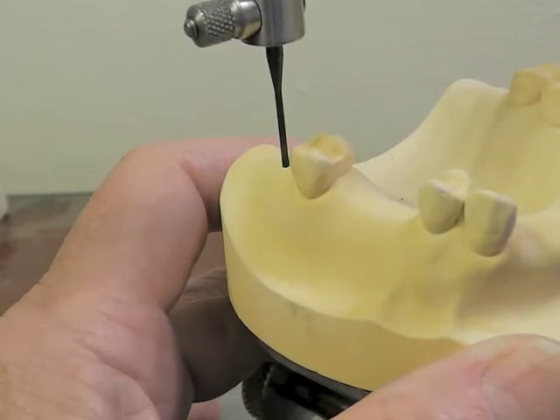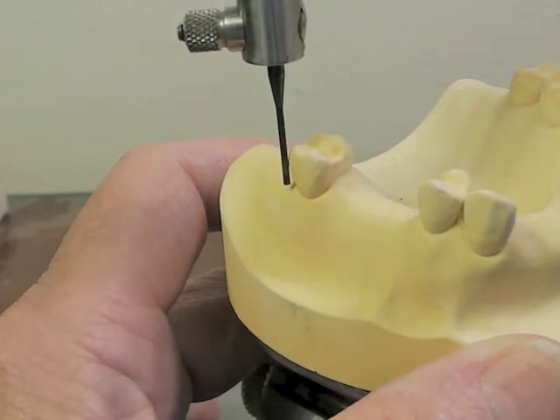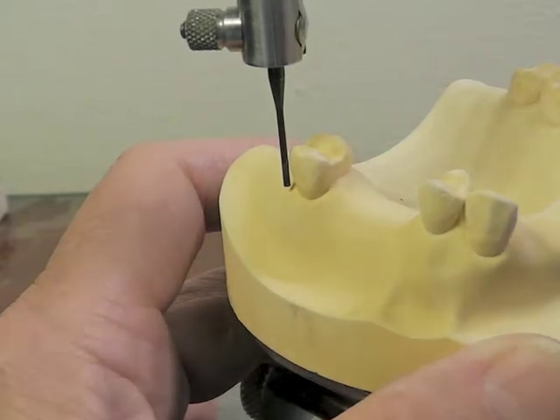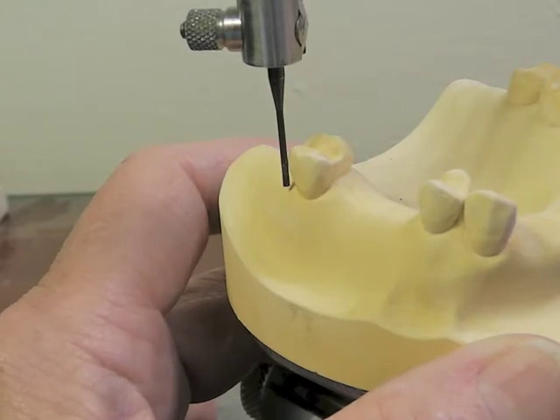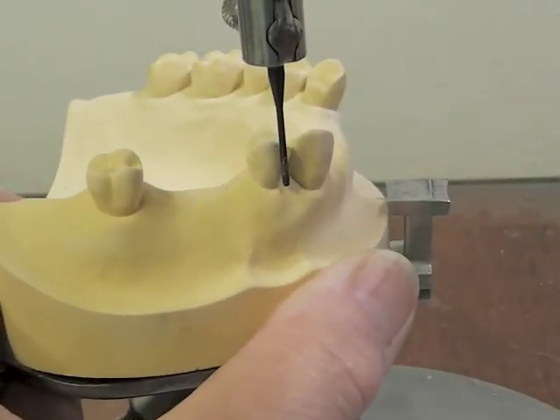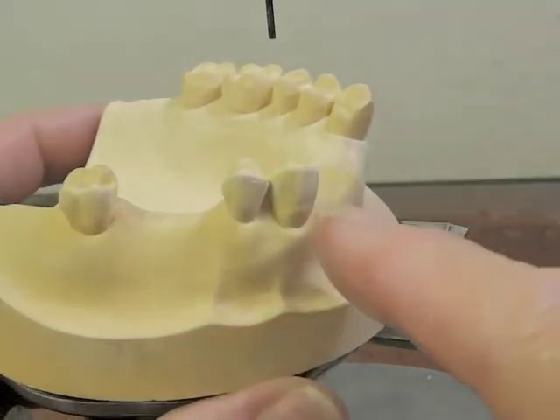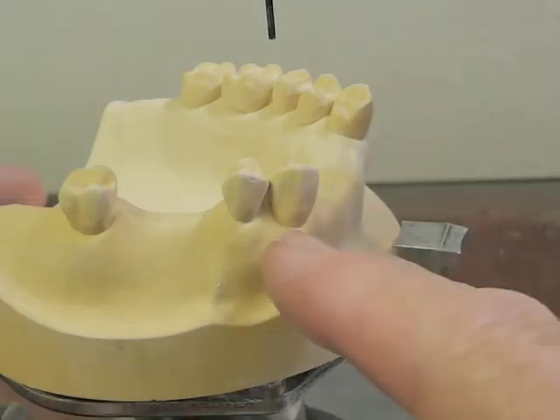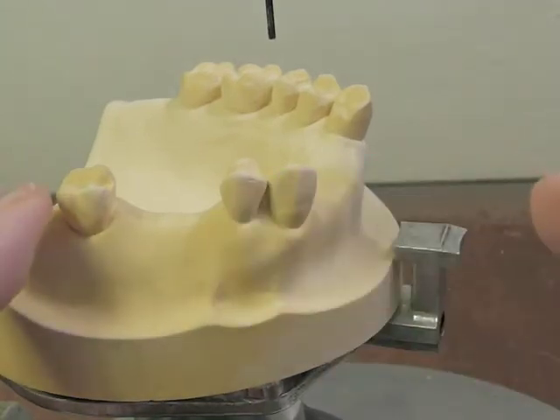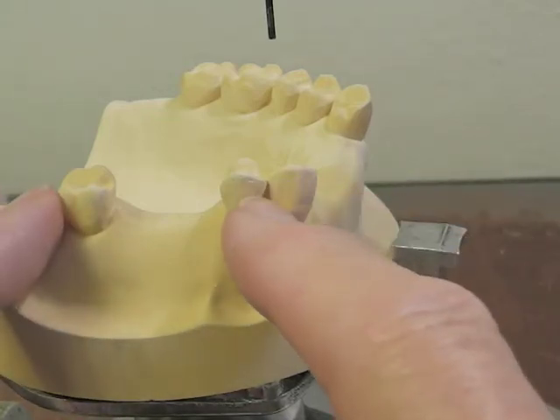We have to find the height of contour of that tooth. We want the rod down at the gingival margin and then look to see whether there is a space below the bulge of the tooth — below the height of contour — which is an undercut. We have one on both of these teeth right now, the way we have this angulated, and it looks really good. We're choosing not to put a clasp on the canine because of aesthetics, and we're avoiding aesthetic problems by placing clasps on those two posterior teeth.